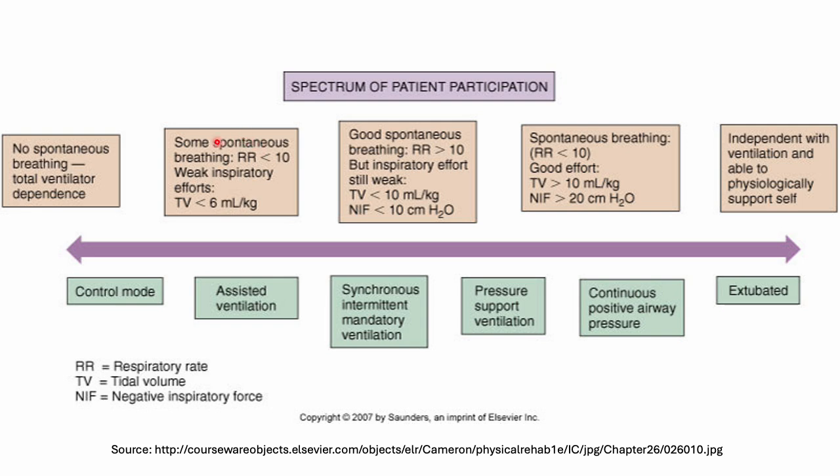In this particular diagram, when they use the term spontaneous breathing, it is different from what I've used. So please differentiate for this particular diagram. When they mean spontaneous breath, it's just initiating, when the patient is on assisted ventilation or controlled ventilation.